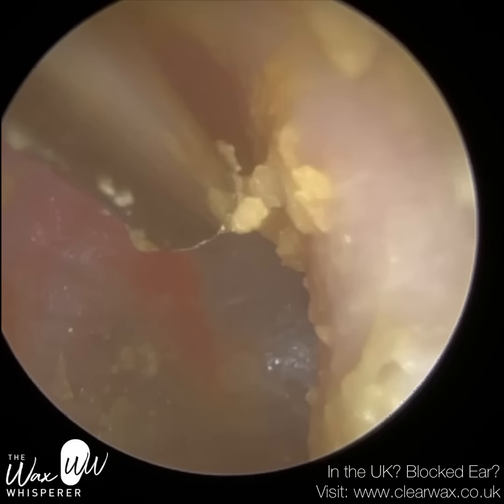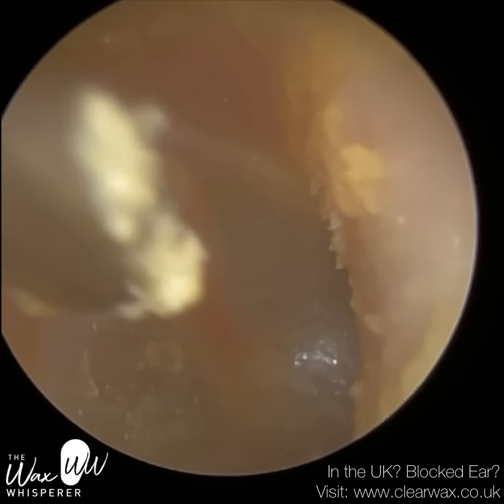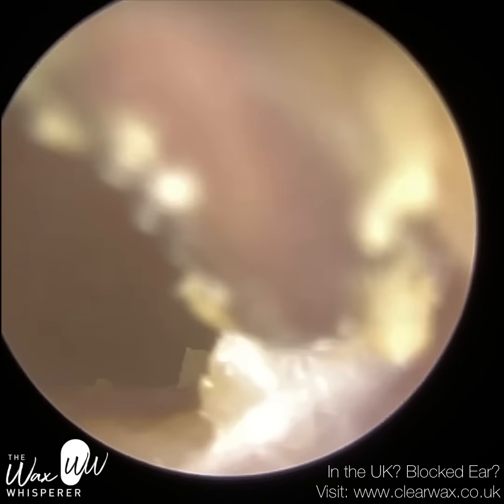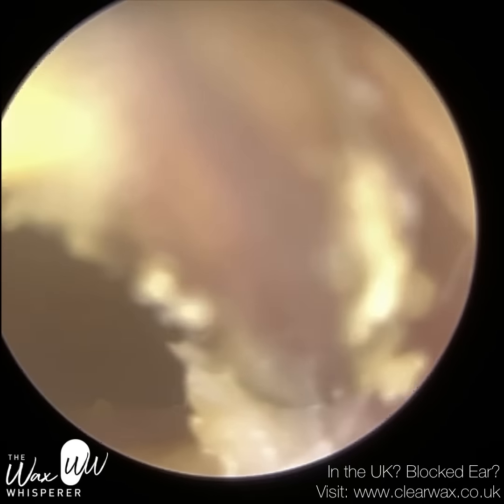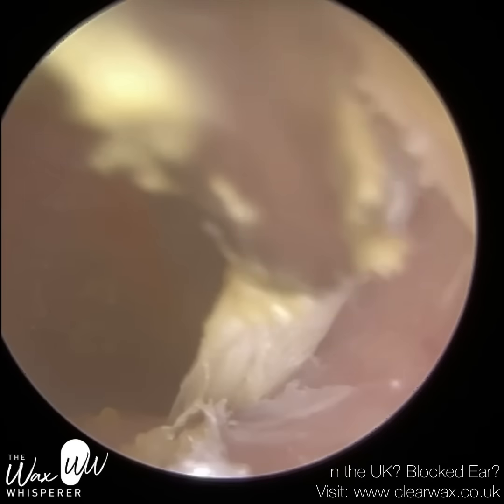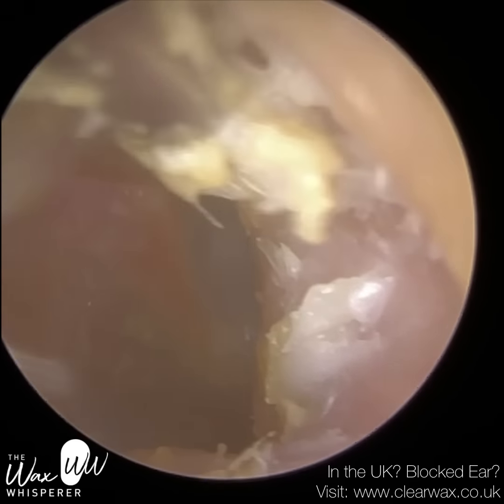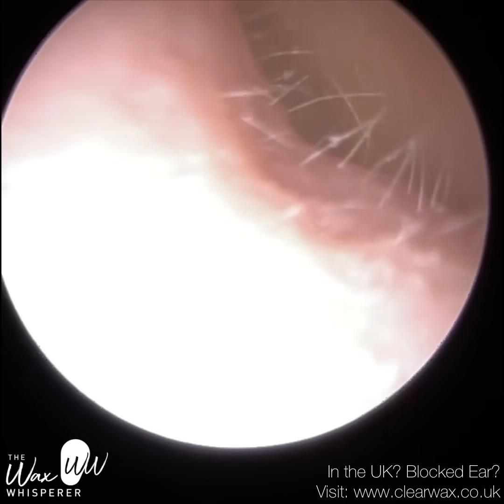I've got a slight attic retraction here — you'll see the top of the eardrum, the membrane, the skin is folded over the hammer bone, creating a little pocket at the top. But it's self-cleansing — there's no dead skin migrating and collecting, because that can lead to a cholesteatoma, which can be very dangerous. You can see the skin underneath looks very healthy. It's just this old skin that hasn't migrated — it's died and shed but remained on the canal wall.